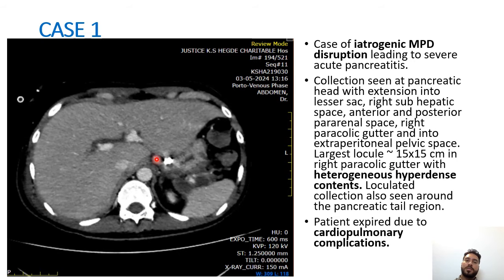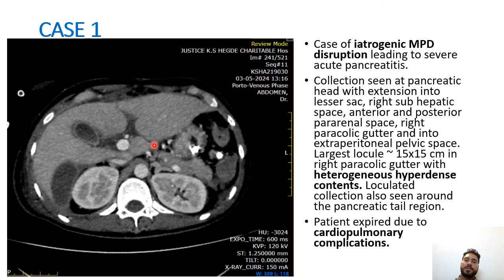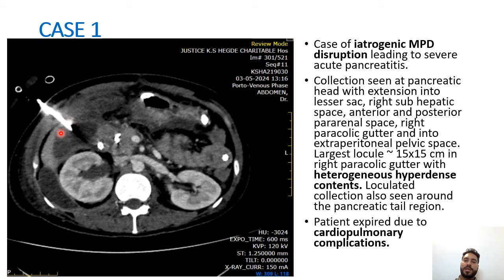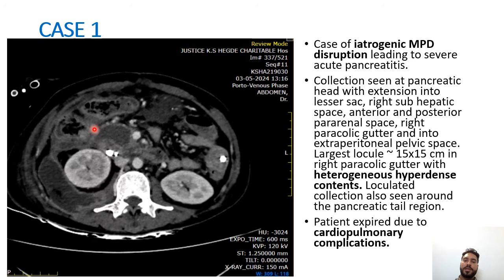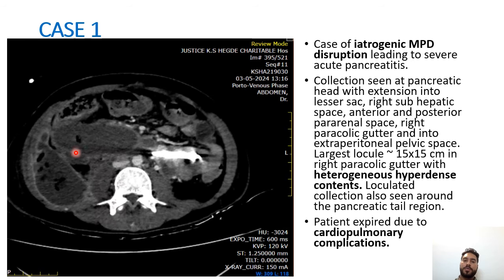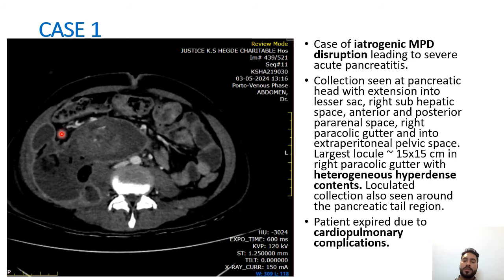This is a case of iatrogenic MPD disruption leading to severe acute pancreatitis. A collection is seen at the pancreatic head with extension into the lesser sac, right subhepatic space, anterior and posterior pararenal space, right paracolic gutter, and into extraperitoneal pelvic space. The largest locule measures 15 x 15 centimeters in the right with heterogeneous hyperdense contents. A loculated collection is also seen in the pancreatic tail region. This patient expired due to cardiopulmonary complications.